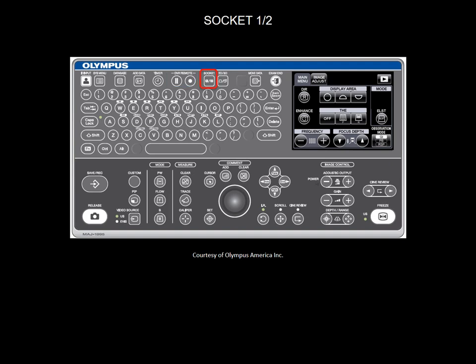The socket key allows you to switch between the endobronchial ultrasound bronchoscope and the radial ultrasound output. Used mainly by gastroenterologists, the 2D 3D button allows a 3D reconstruction of digestive lesions images.